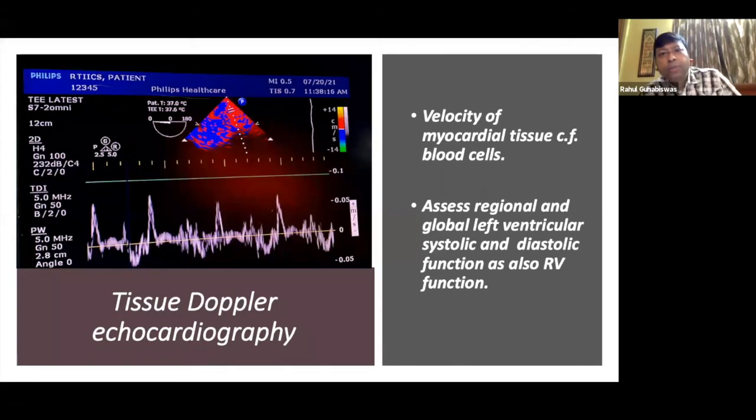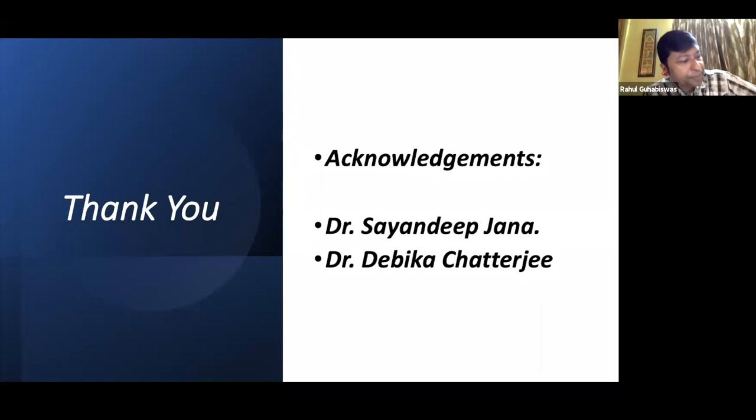Finally, we come to tissue Doppler. Here, velocity of the myocardial tissue is measured as opposed to velocity of blood cells. Tissue Doppler is routinely used to assess left ventricular systolic and diastolic function, as also right ventricular function.